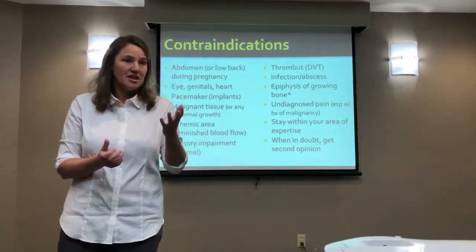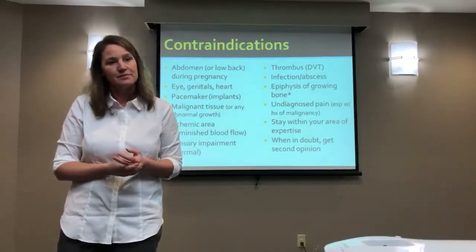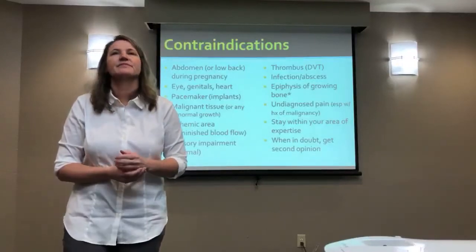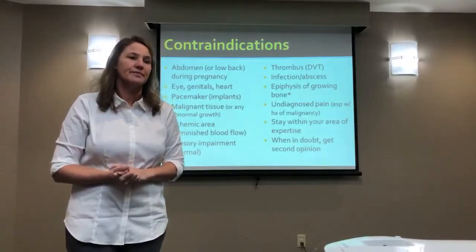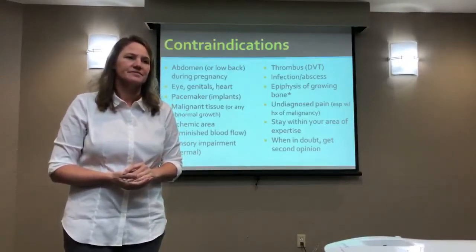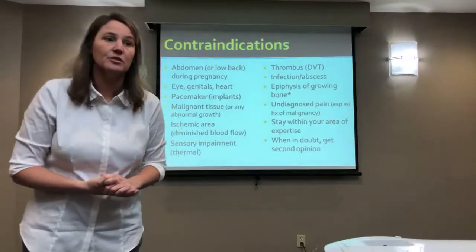I mean, have you seen any really recent research studies looking at these subjects? A lot of the research is not solely ultrasound. You look at the research and it's ultrasound and exercise. So, not well controlled. So when you get to the non-thermal effect, there's really nothing out there that's going to say it's absolutely proven. Yeah, I do agree with you.